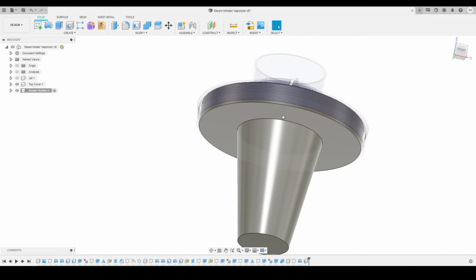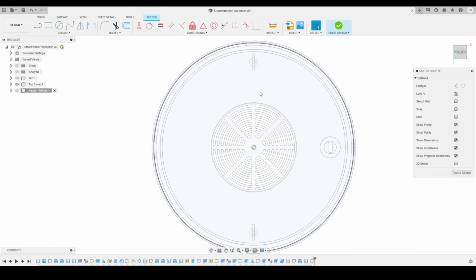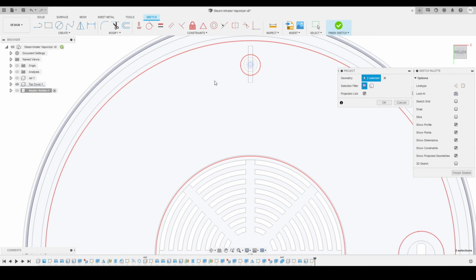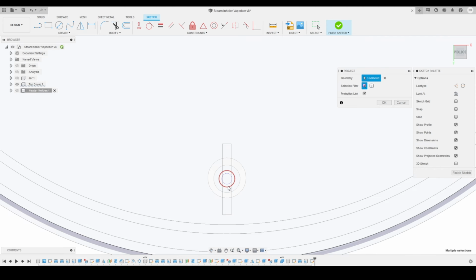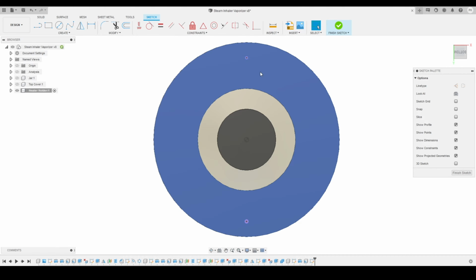Here you can see I will click on the create a sketch tool, and then I will just turn off the heater holder because I'm going to project few sketches from the top cover. So I will go on to create panel, then project tool, and I will select the entities that I want to project. So these are all circles that I want to project onto my current sketch plane. So I will just select all the circles and will press OK, and it is giving me an error because it was not turned on. So I just turned on the heater holder, and here you can see these are the projected circles.